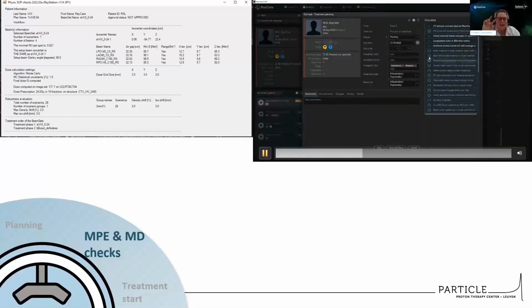So that saves us not having to toggle between all of the RayStation tabs too often. So that does save us some time, but for the other half of the RayCare checklist, because we have 30 questions in there, we still manually look at some parameters.